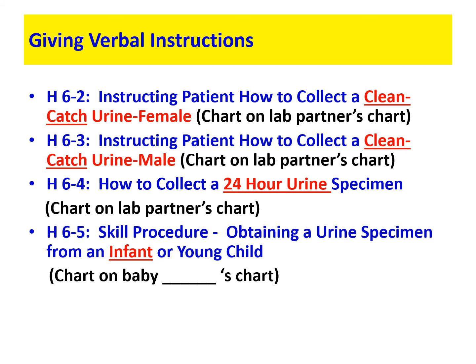So you have a lecture up on Canvas for chapter 3 on urinalysis that you guys should have already watched, filled out your study guides. You should have read chapter 3 in your textbook.